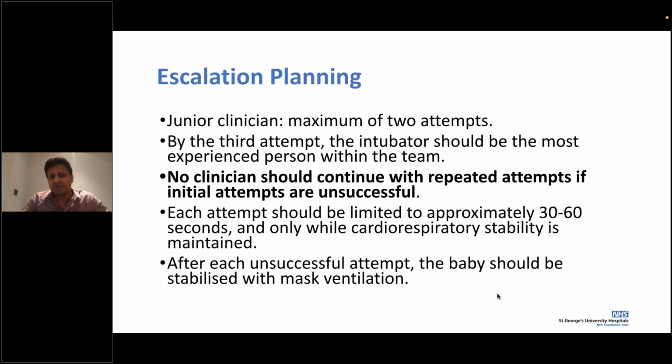Quite often there is a preparation phase and a discussion around escalation planning, and if you're taking too much time between your attempts, or when you're visualizing, then there is a timekeeper who will say the heart rate is going down, or a senior nurse who would say the heart rate is now 100 or 90.